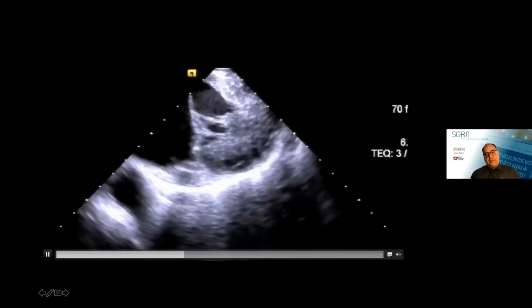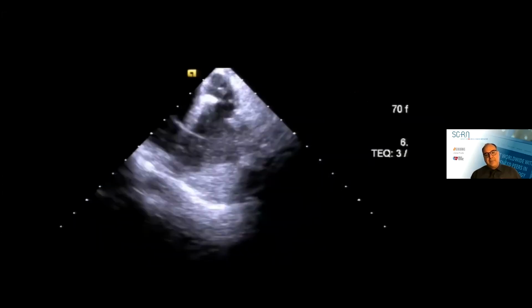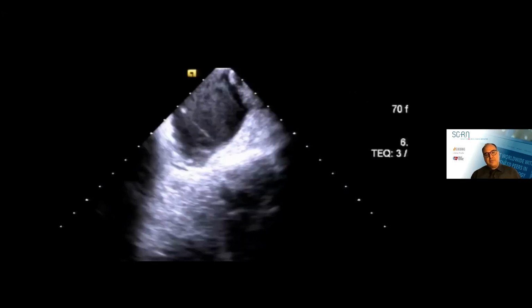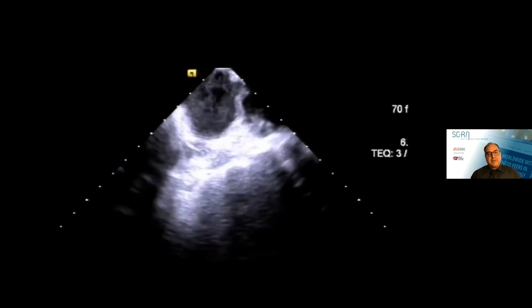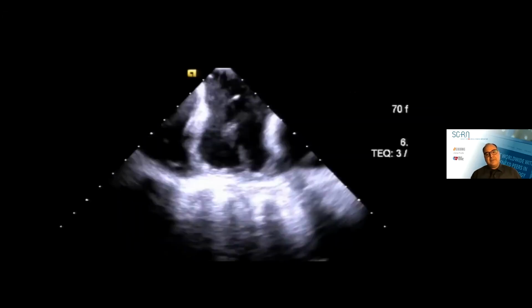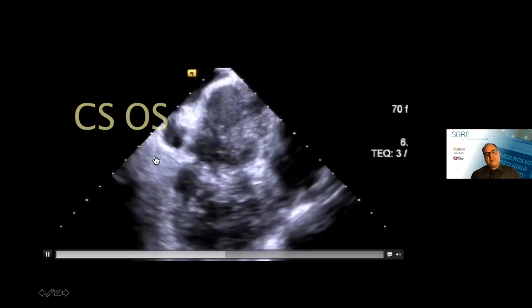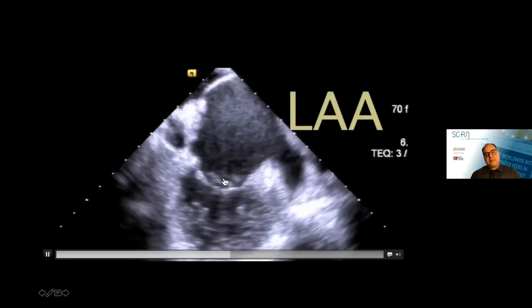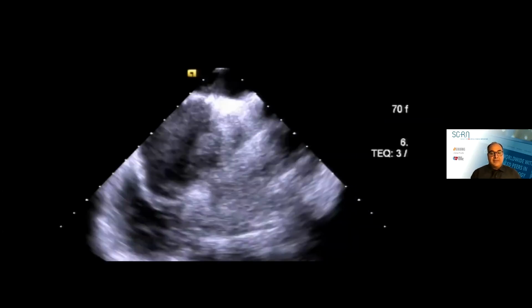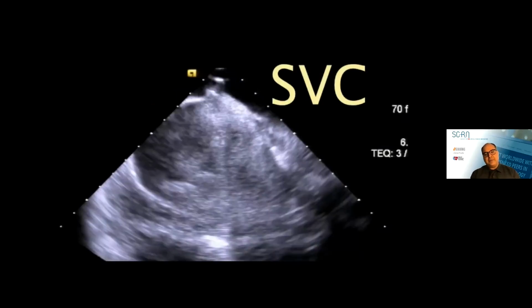Afterwards, we come slowly out of the right ventricle back to the RA. Right at the base of it, you will see the ostium of the coronary sinus. You can mark that if you have a special echo probe, right about this point. So that's the os of the coronary sinus, and you see the mitral annulus far out, and the left atrial appendage on the farthest side of it. This is a very good image of it, although I wouldn't rely on this one to rule out left atrial appendage clot. If you want to do that, you have to use other views, which I'm not going to discuss today.